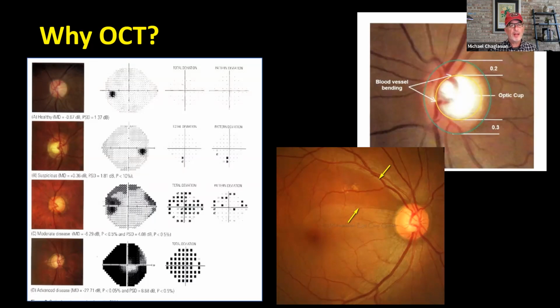Certainly, we know that OCT is just part of the diagnosis paradigm for glaucoma patients, and we'll continue to reinforce that tonight because, while OCT is very important, it's not the only thing that we need to identify glaucoma in our patients. A lot of what we'll be talking about tonight is represented by that diagram on the left, which is what we refer to as the structure and function.